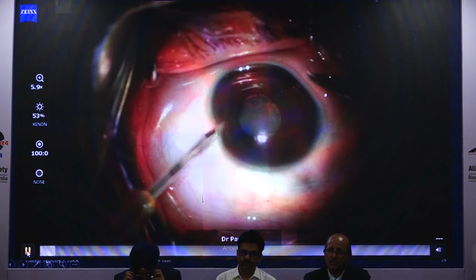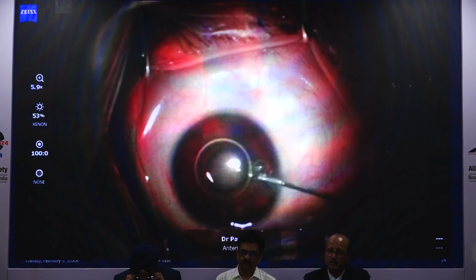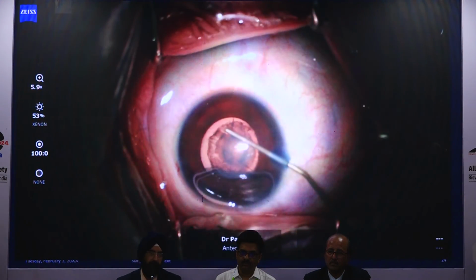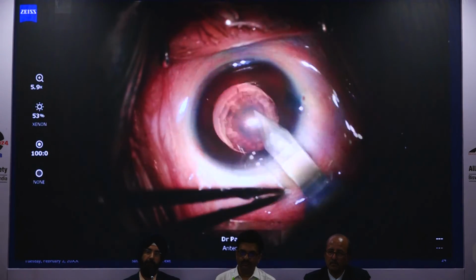This is another video in which we used triamcinolone intracamerally to prevent post-operative inflammation.